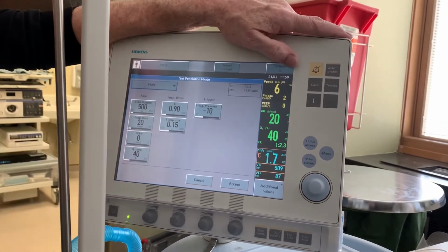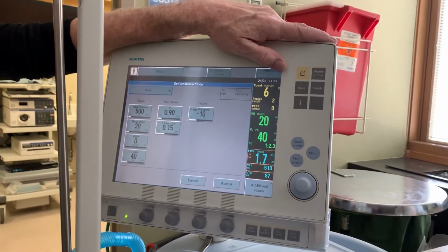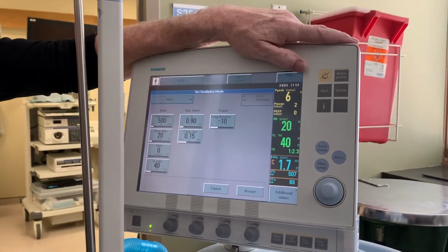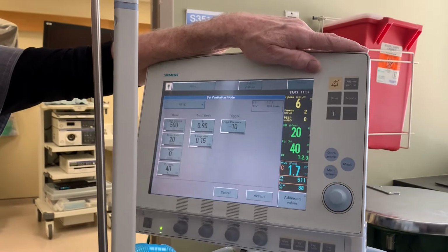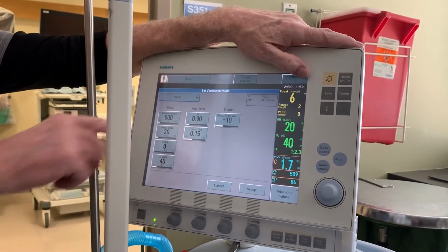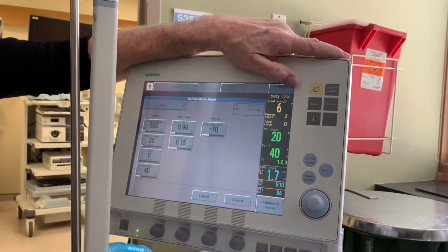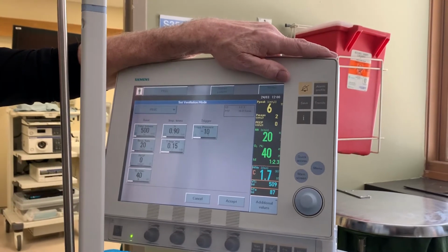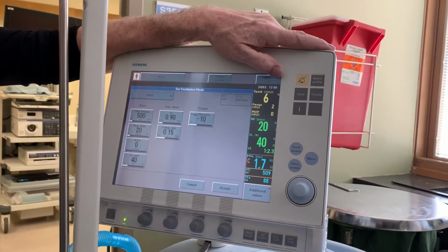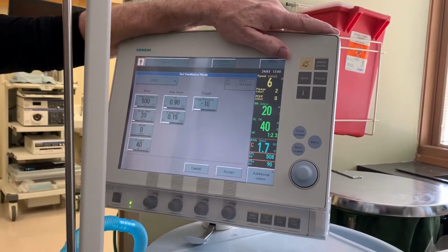There's a rate control here. That will be based upon the physician's determination of what adequate backup ventilation is, and 20 breaths per minute means every 3 seconds. It's designed to deliver a breath, and it's giving you a guarantee of at the very least 20 breaths per minute for that period of time. But any breath that the patient takes, this machine recognizes it by triggering, and the breath is delivered according to what the volume is set here and what the oxygen concentration is set here.